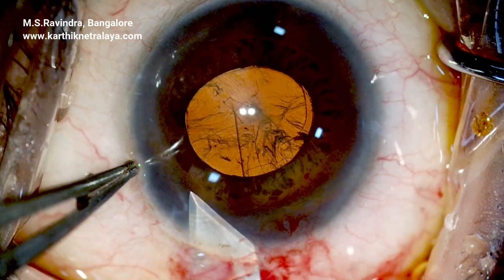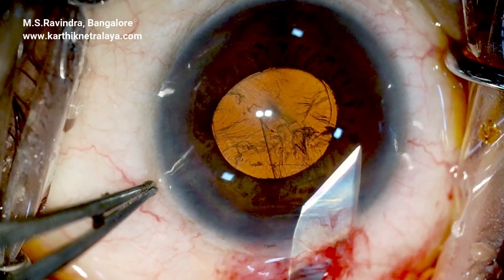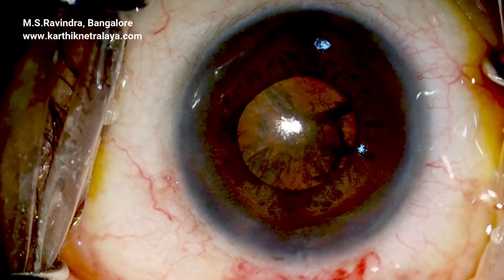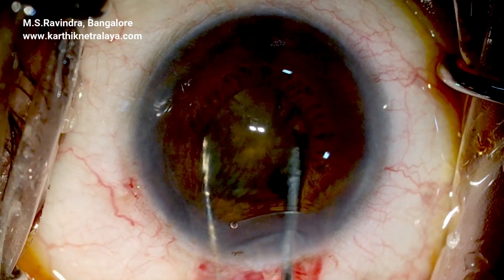The cystitome enters by puncturing the floor of the tunnel so there is no loss of viscoelastic from the eye. The tunnel is completed to adequate size, with the inner length of the tunnel slightly larger than the outer.